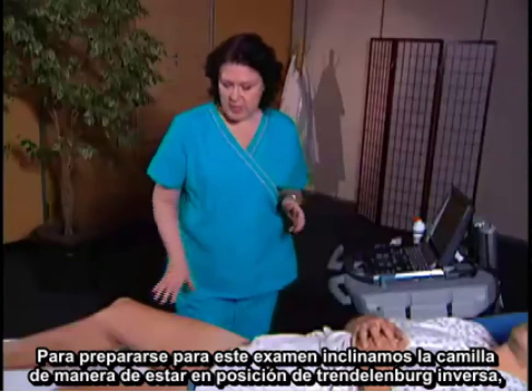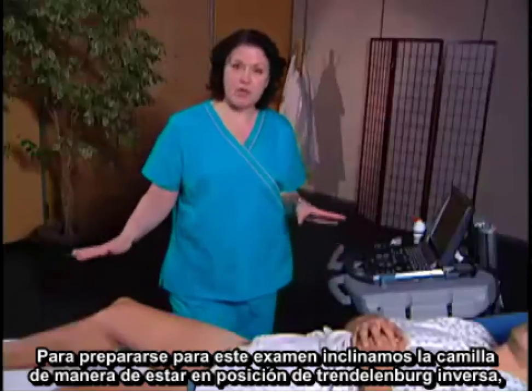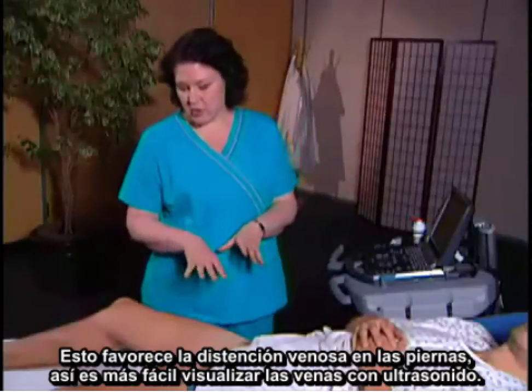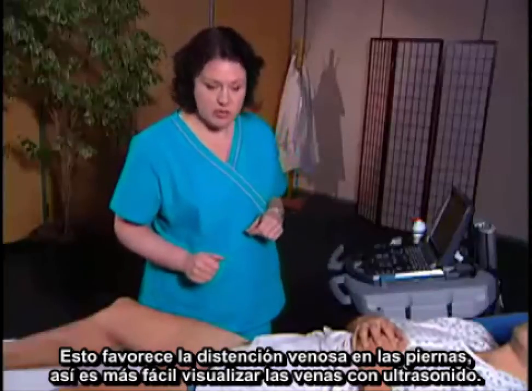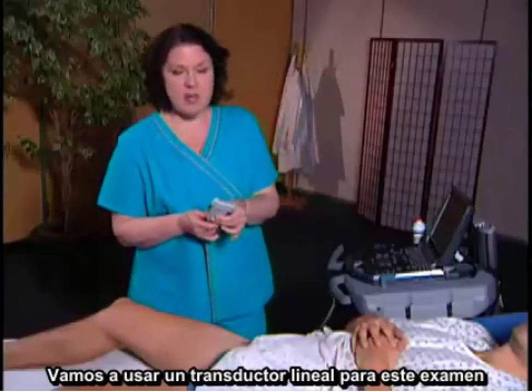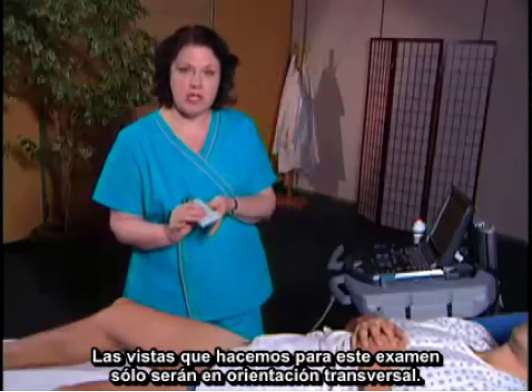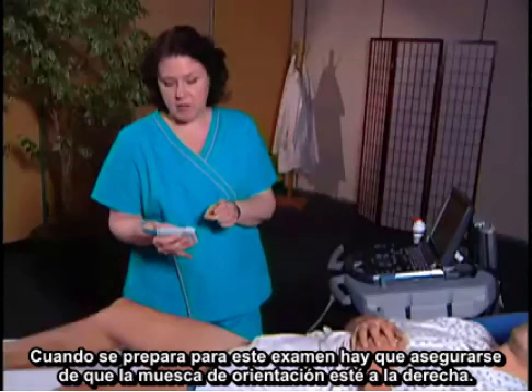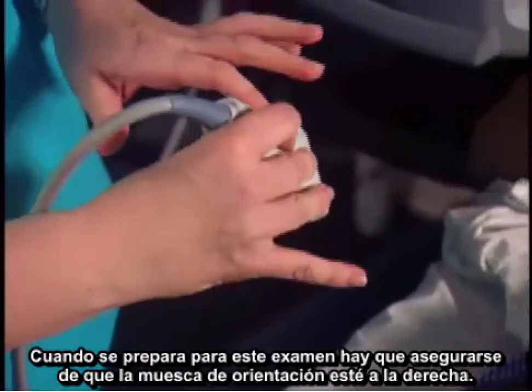To set up for this examination, you want to tilt the gurney so that you're in a reverse Trendelenburg, so this encourages venous distension in the leg, so it's easier to visualize the veins with ultrasound. We're going to use a linear transducer for this examination, and the views that we do for this exam will just be in a transverse orientation only. So when you're setting up for this examination, make sure the orientation marker again is to the right.